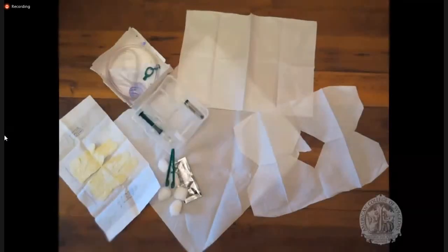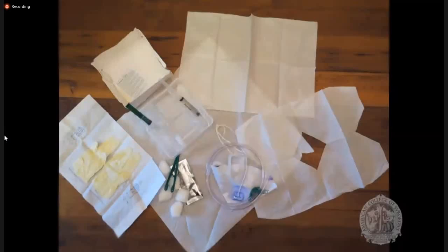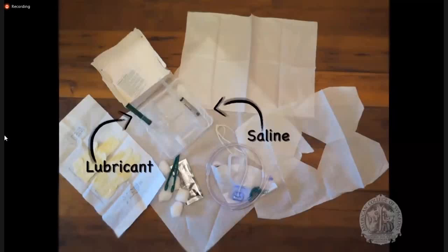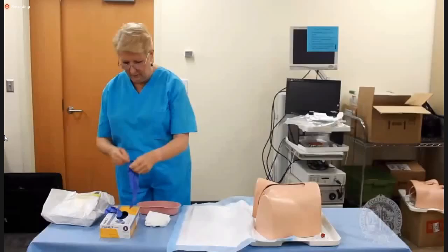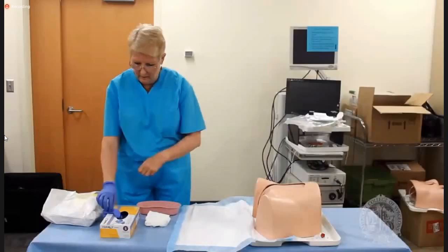In addition to the catheter, you'll need cleaning towelettes or soapy water, non-sterile gloves, absorbable pads, sterile gloves, a fenestrated drape, betadine or iodine with applicators for preparing the patient, lubricant, a sterile syringe with water or saline, and a collection system. In this video, we will be focusing on placement of a Foley catheter in a patient with a vulva.